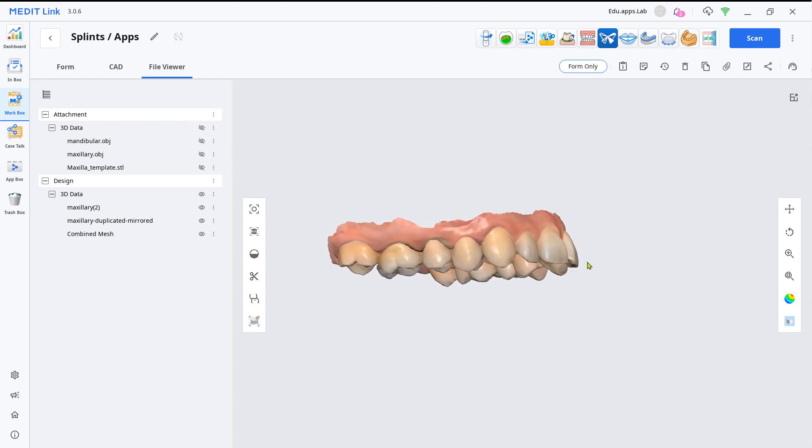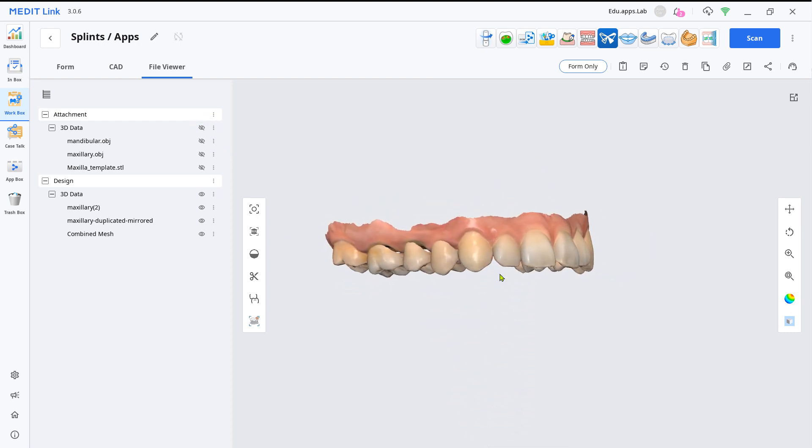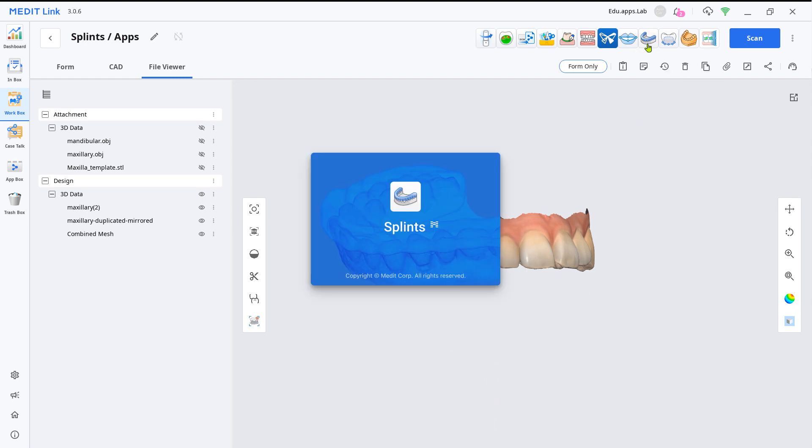Now load the Splints App and use the combined mesh as a replacement for the missing teeth data.